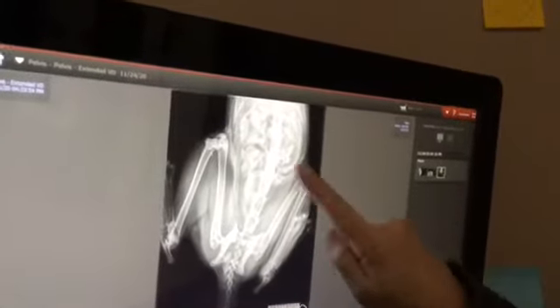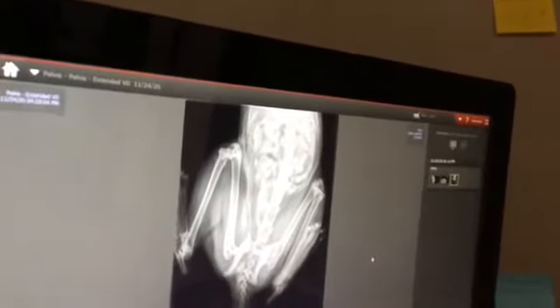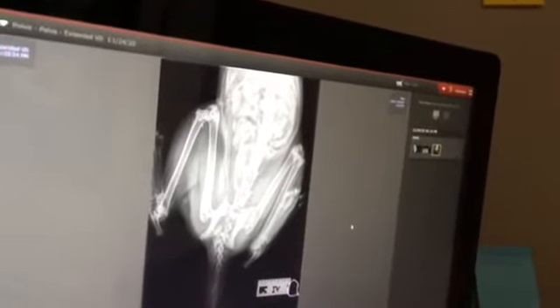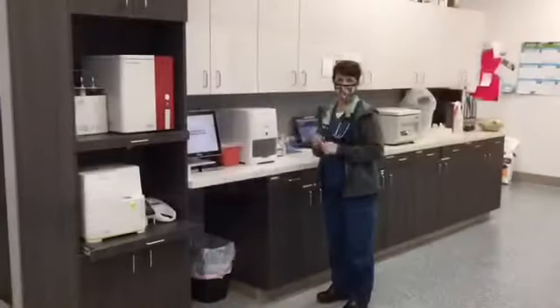And I see a little bit of his tummy. He's got some food there in his intestines. And this is his left leg that's kind of coming off the screen there. And this again is his long tail. So again, we just kind of let him sit there, and we were looking at this area here on that radiograph.